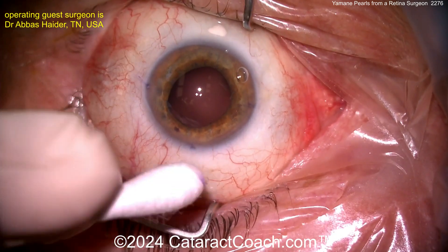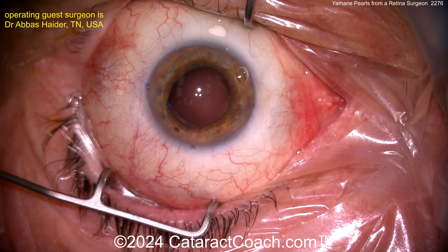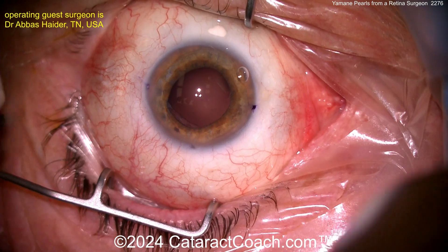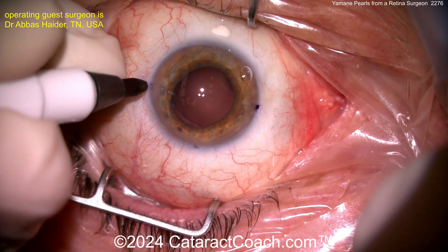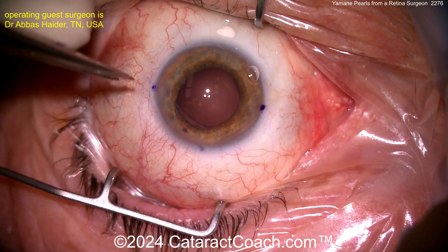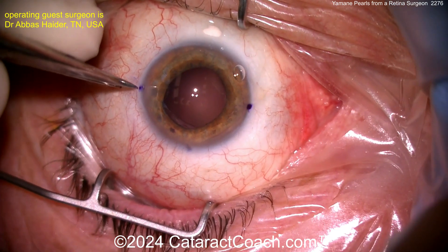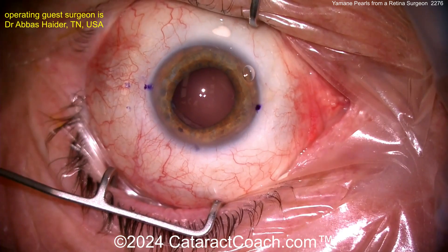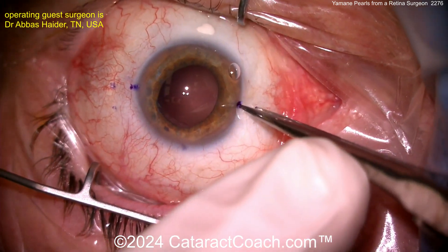You've got two marks now at the limbus, 180 degrees apart, plus another one at the top at 90 degrees. Making your marks here so that when you place your trocars, you're going to have this IOL placed beautifully. Now I'm measuring two millimeters back and then two millimeters to the side, and this is going to make it a lot easier.